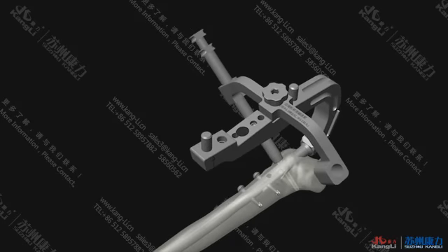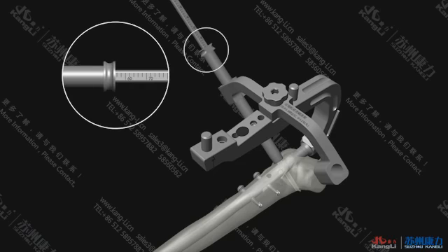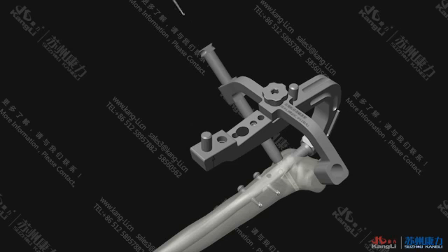Remove the phi 3.2 drill bit and the inner sleeve. Keep the outer sleeve closely contacted with the bone cortex and insert the guide depth gauge to measure the diameter of the bone. Choose the phi 5.0 locking screw with appropriate length and screw it in with the 3.5 hexagonal screwdriver.